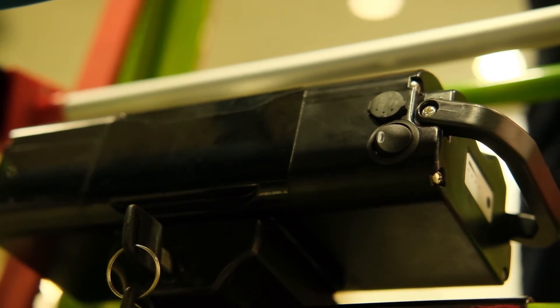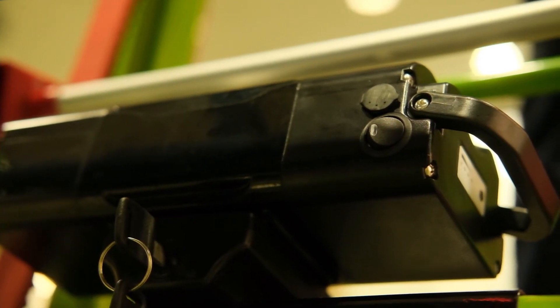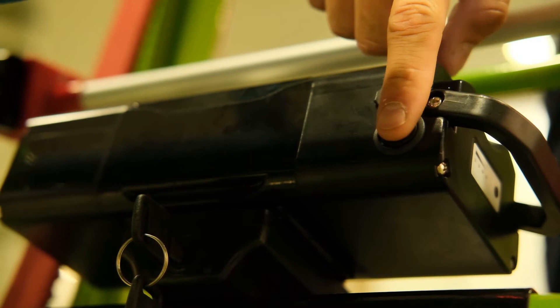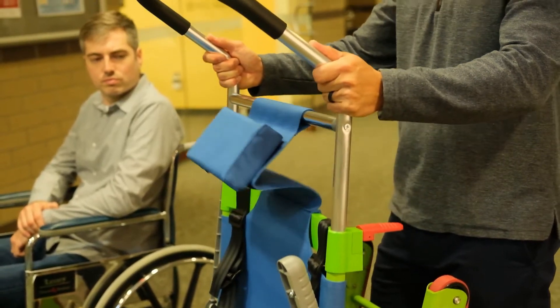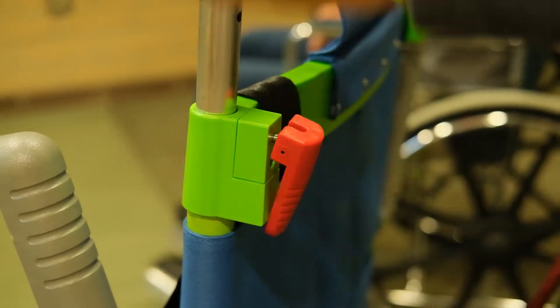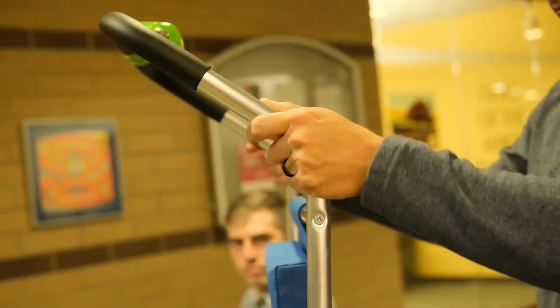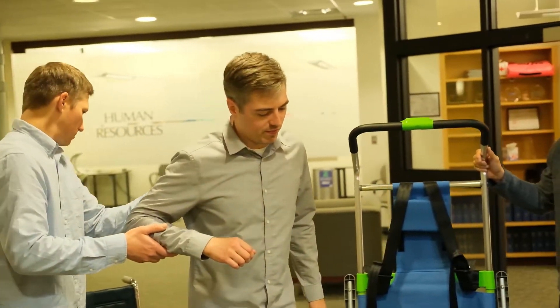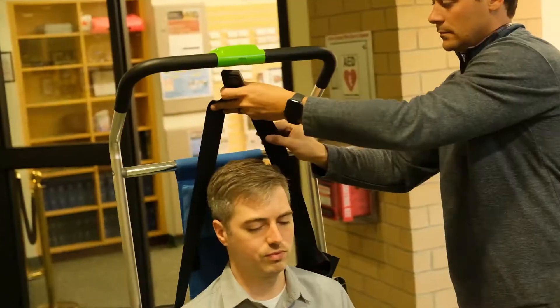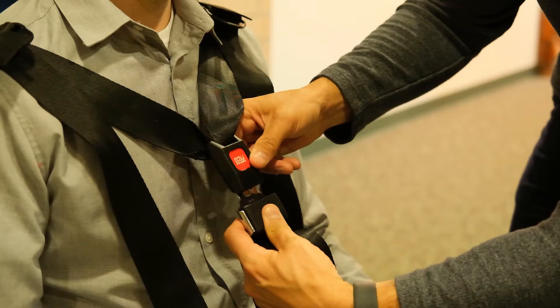Check that the battery is installed. If it is connected to its charging cable, remove it and ensure the power is switched on. Open the two red spring clips that allow you to raise the handle. Once raised, close the two red spring clips and ensure they've been engaged to lock the handle in place. Transfer the person onto the seat according to your personal emergency evacuation plan and fasten the support harness over their shoulders.